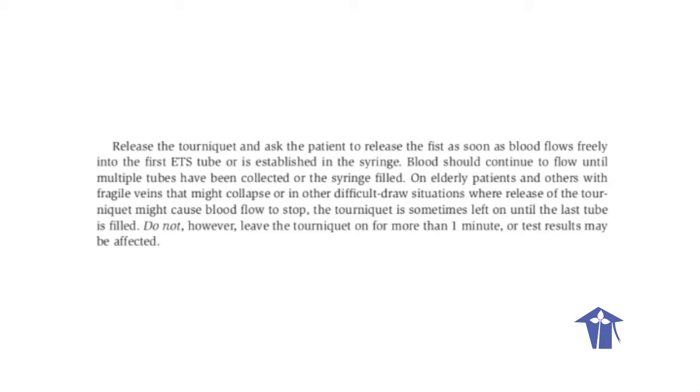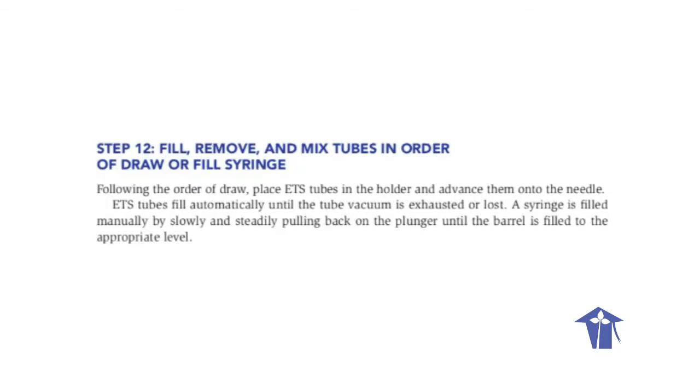On elderly patients and others with fragile veins that might collapse, or in other difficult draw situations where release of the tourniquet might cause blood flow to stop, the tourniquet is sometimes left on until the last tube is filled. Do not, however, leave the tourniquet on for more than 1 minute or test results may be affected. Step 12. Fill, remove, and mix tubes in order of draw or fill syringe.